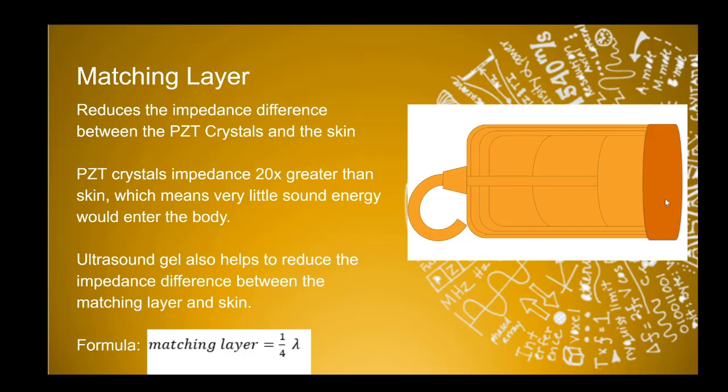A second thing that we put in between the transducer and the skin is our gel. And remember, our gel is water-based. Remember, water-based things have very low attenuation. And so that is going to, again, act as another conduit to get the sound into the body.